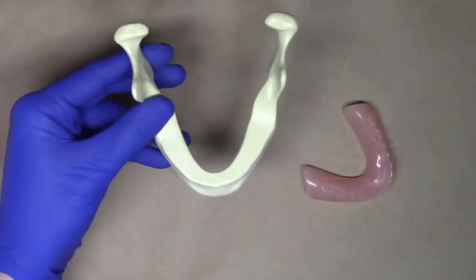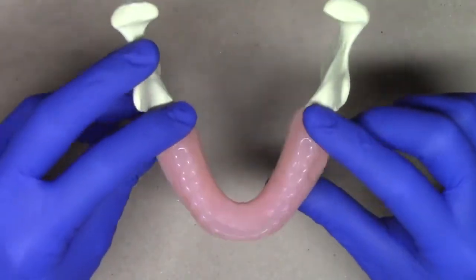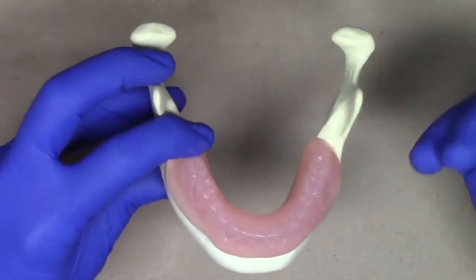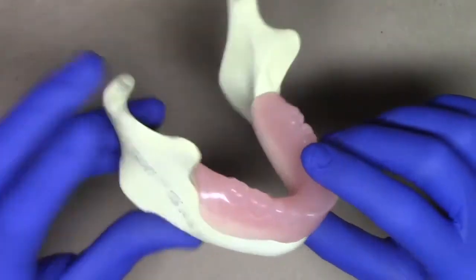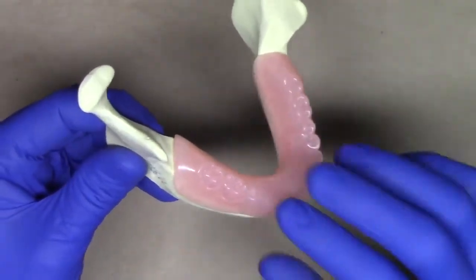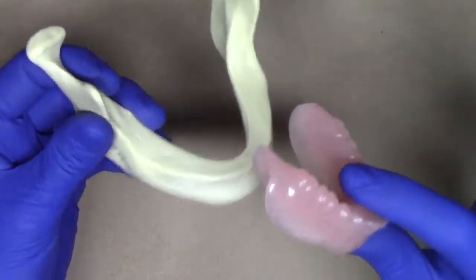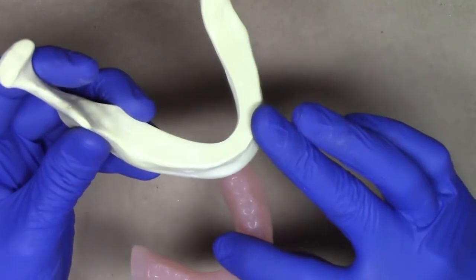We have our patient's existing complete denture, and this is simply a simulation of a clinical situation of a patient who presents to your office who would need the stabilization of 4 LODI implants in the anterior mandible or potentially in the maxilla. This is just showing you an example of a replica sawbones style styrofoam mandible. Imagine this is our patient sitting in our clinical chair. They say, I'm interested in having my denture stabilized. Yes, of course we can do that for you. What we'd like to consider is 4 LODI implants in the anterior mandible.